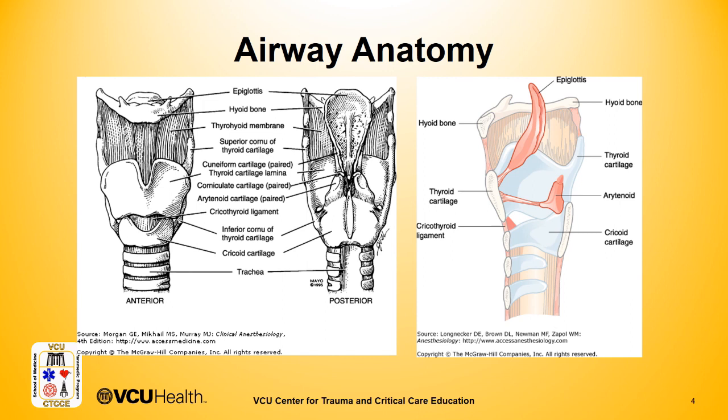The best way to find the anatomy on palpation is to start at the sternal notch. Start at the bottom and work up. Palpate the sternal notch, and then as you work up, you will feel the trachea. Slide your finger up the trachea until you feel the first bump. The first bump is the cricoid cartilage. Then you will feel a divot. Then there is a second bump. The second bump is the thyroid cartilage.